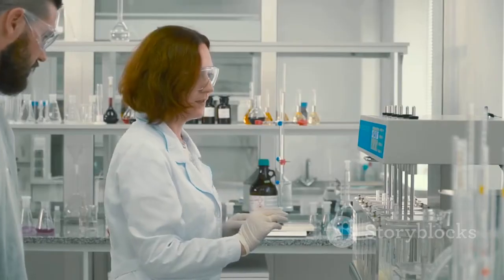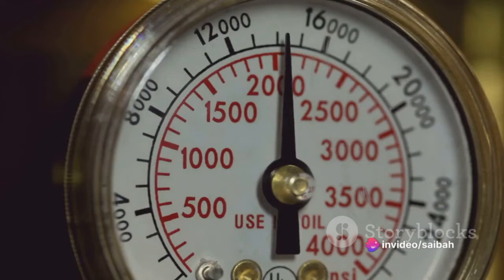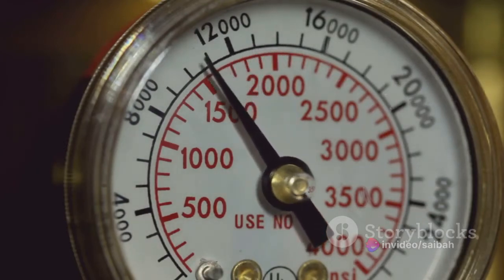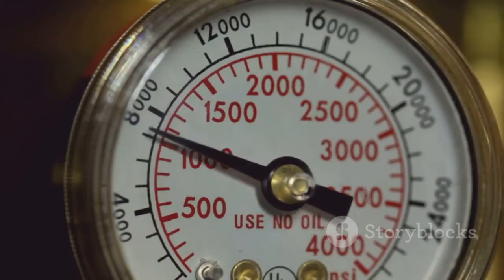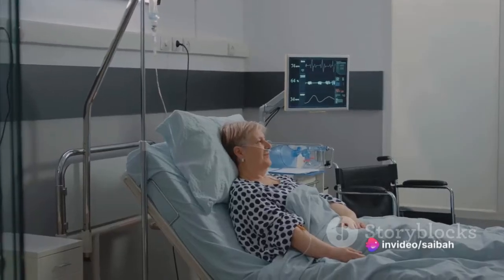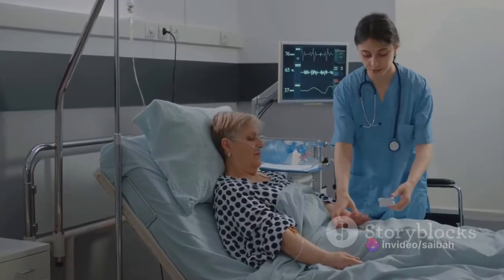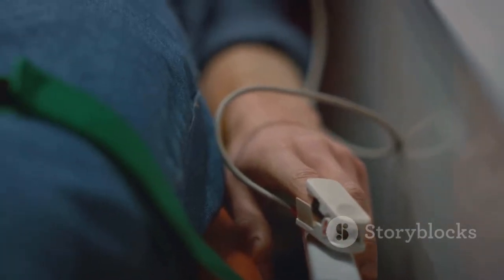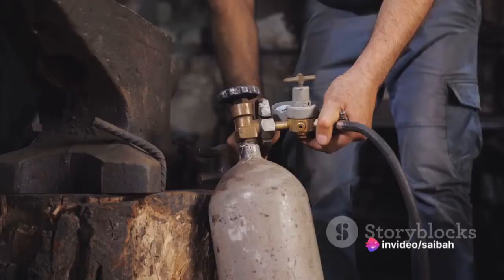While the nitrogen is flowing, it's time to adjust the analyzer. Look for a knob or button labeled 'zero' — this is what you'll use to set the analyzer to zero. As the nitrogen flows, you should see the reading start to drop. Once it hits zero, gently adjust the zero knob until the reading stabilizes at zero. Patience is key here; you may have to wait a little while for the reading to stabilize, and that's perfectly normal. Don't rush this step, as an accurate zero calibration is crucial for the rest of the process.